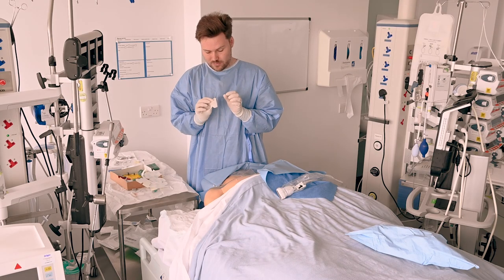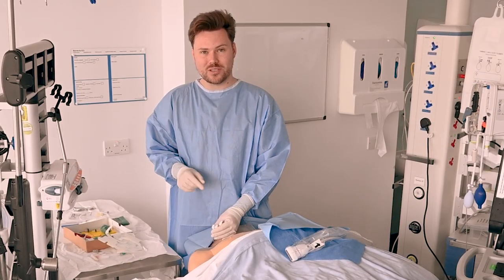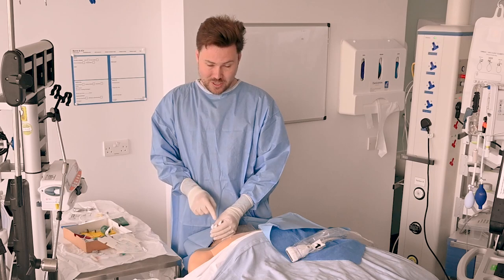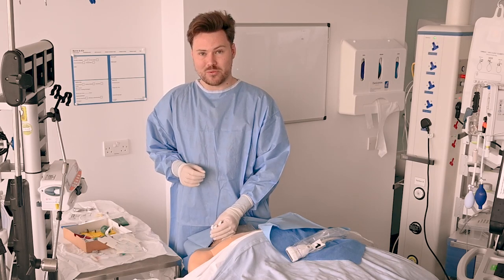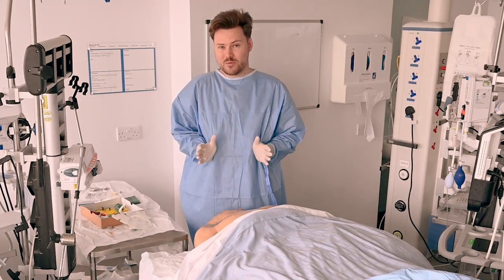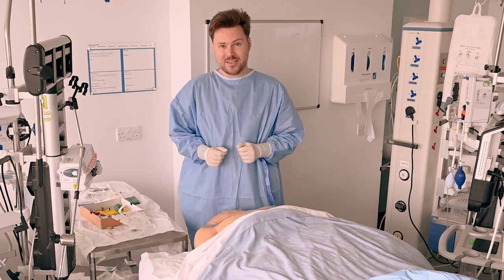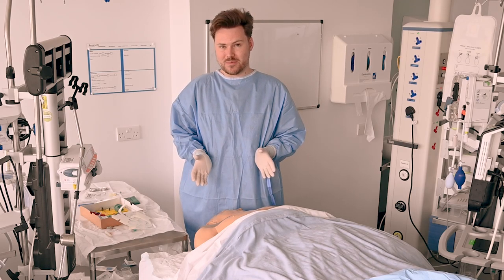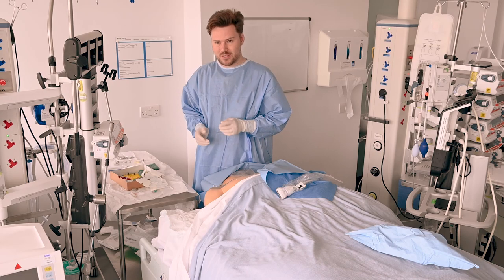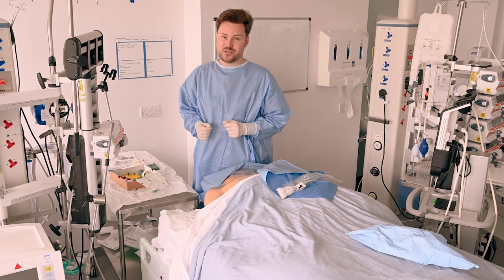Make sure to date all of your lines — ours always come with an additional sticker just for this purpose. Before I leave the bed space, it's important to confirm my line using the additional checks. The ultrasound we used is useful but not confirmatory. I'm going to take a venous gas to confirm what the saturations are, and I'm going to transduce the line to make sure that I see a venous type pulse flow on my monitor. Also remember to reposition the patient into a 30 degree head up, or wherever they're most comfortable if they're awake, and then it's time to order a chest x-ray — on that you're looking for any complications that might have been caused, as well as to confirm the tip of the line is in an appropriate place. Make sure your sharps are put away in the sharps bin and the rest of your equipment is disposed of, including cleaning up the ultrasound. Then it's on to documentation — you can do that on Cerner or whatever system you use.